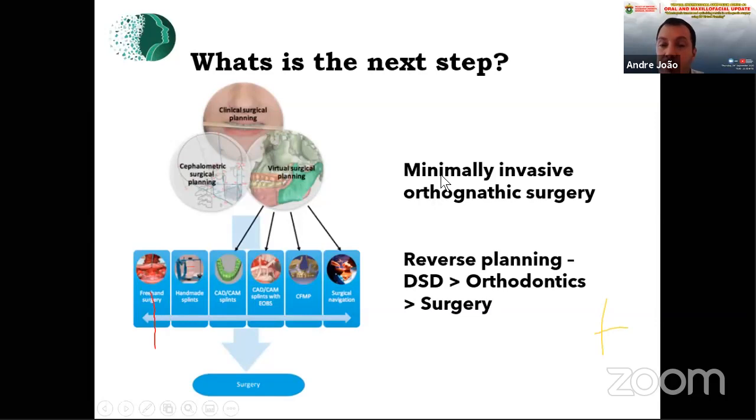He has changed the osteotomies a little, so he can do a maxillary Le Fort osteotomy using a 2-3 centimeter incision on each side of the maxilla, and very small incisions in the mandible, and he's getting very good results.